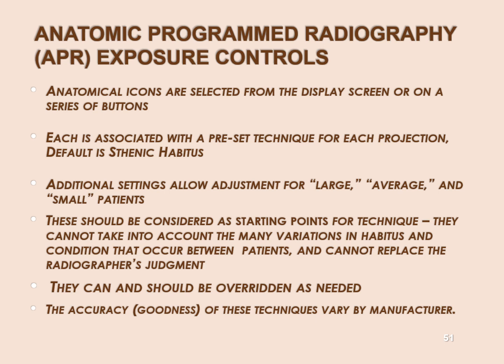And it's going to suggest to you a technique that the manufacturer has tested on, what do you call those, phantoms. And so typically you find, I would say greater than 90% of the time, those preset techniques are perfect. They work.